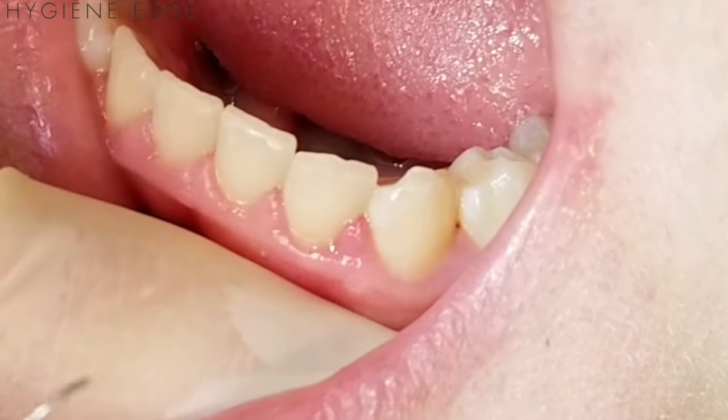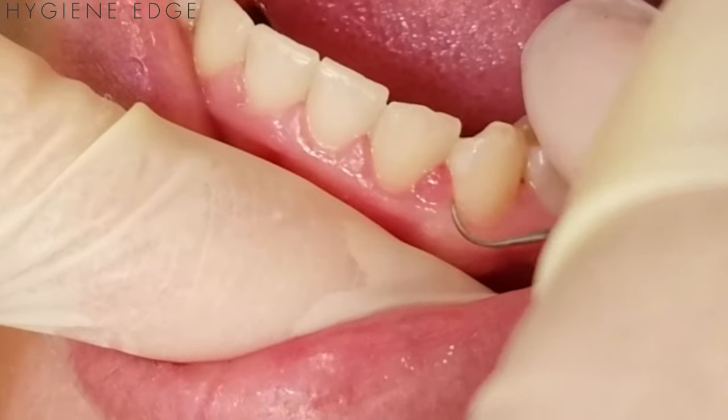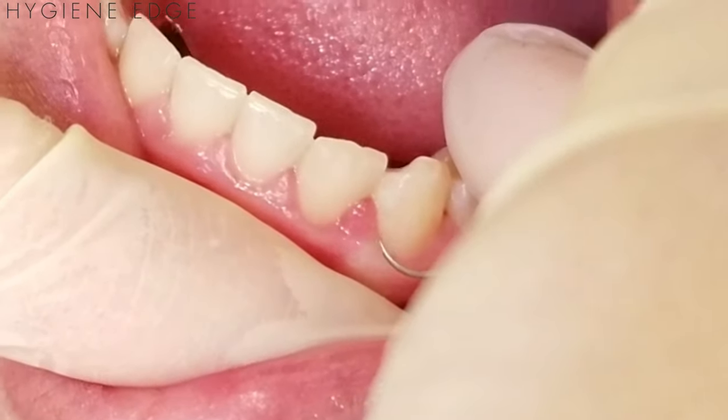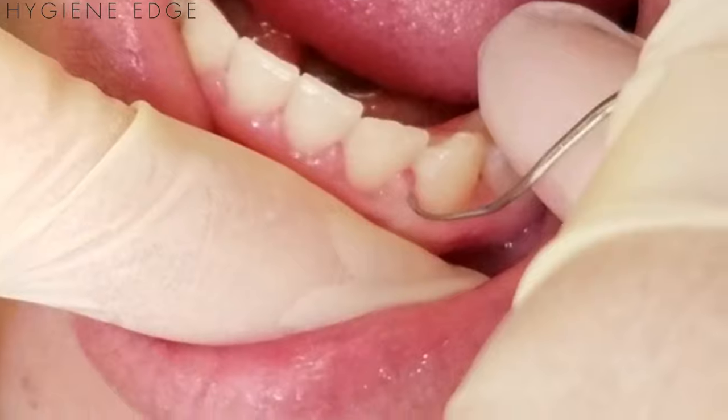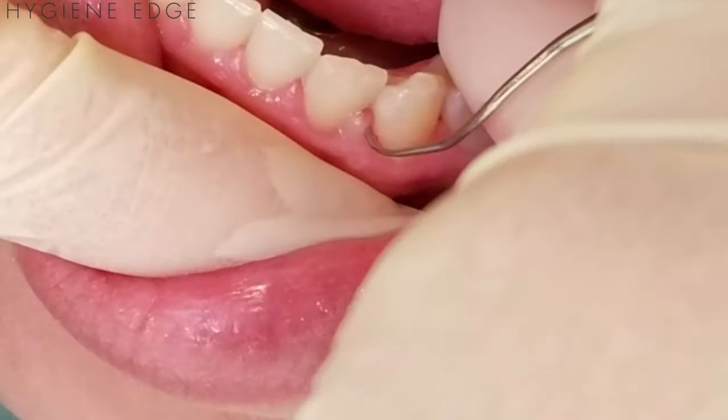We've got some calculus under there. So I'm going to take my explorer and explore starting at the line angle, working myself back, and I'm going to get stuck right underneath this piece of calculus there.